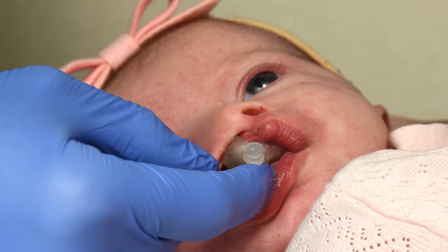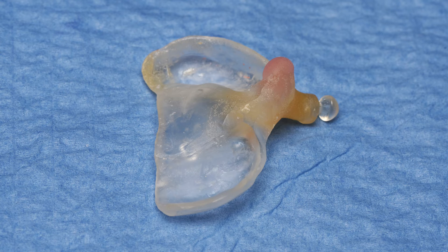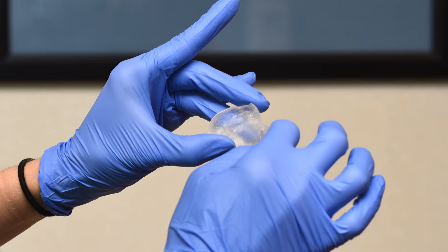Here you can see at the top of the appliance some soft pink liner, which helps to gently move the gums as well, as the button, which helps stabilize the NAM when it is inserted. Over time, the mouthpiece is adjusted to guide the growth, which rotates the gums together and closes the cleft.